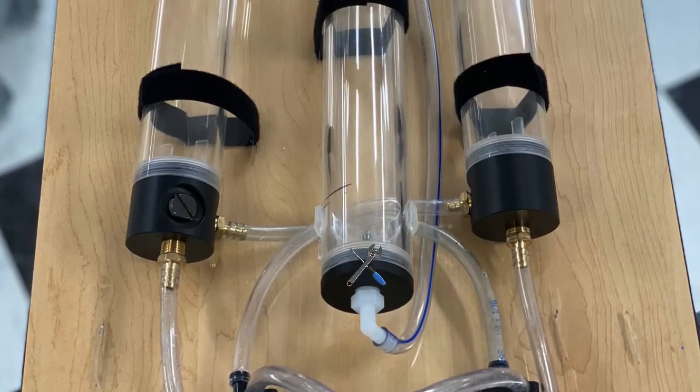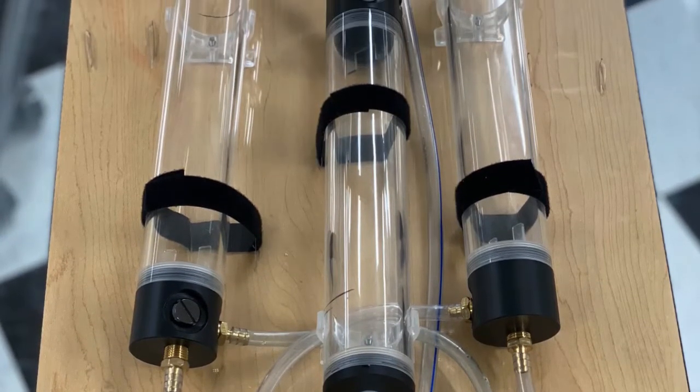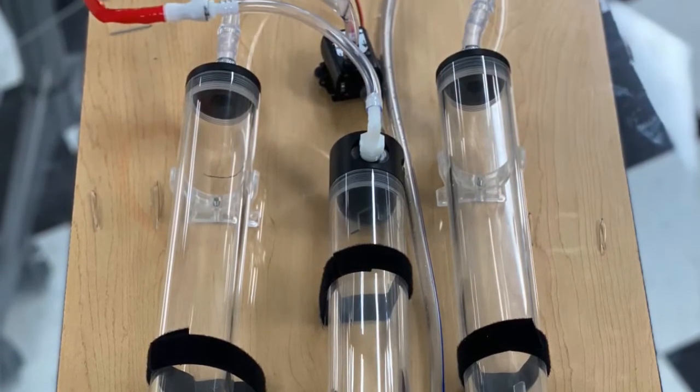Next up, all the lines and water reservoirs are installed. The plastic holders you see beneath these reservoirs are used to angle them to give a simple gravity pressure to the fluids they will hold later on.